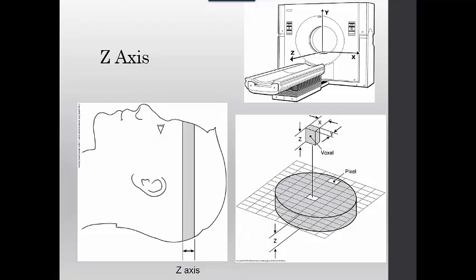The data that form the CT slice are further sectioned into elements. Width is indicated by X, and height is indicated by Y. Each one of these two-dimensional squares is a pixel or picture element. A composite of thousands of pixels creates the CT image that displays on the CT monitor. But if we take the Z-axis into account, then the result is a cube rather than a square, and the cube is referred to as a voxel or a volume element.